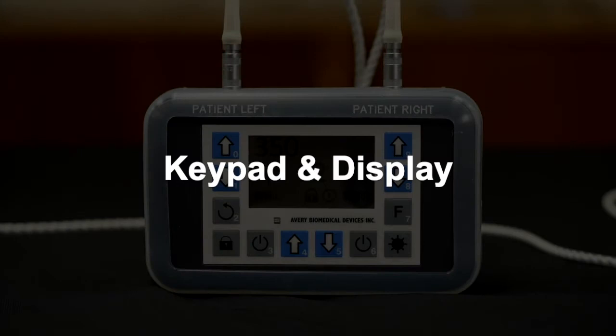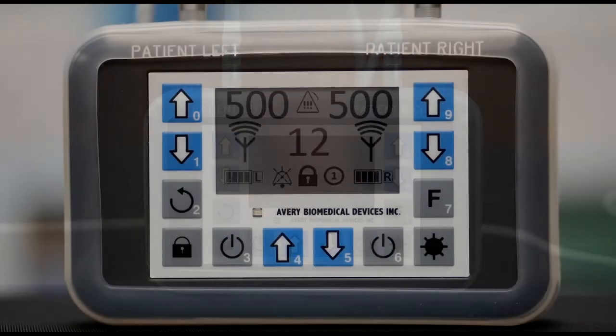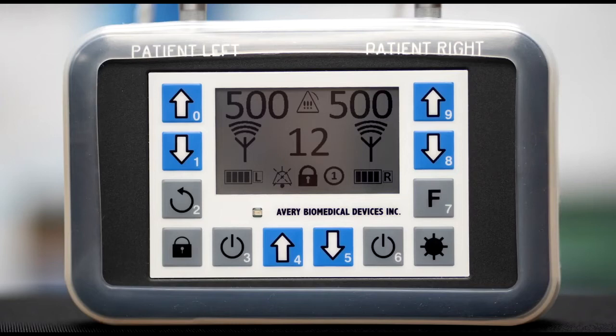Keypad and Display. The keypad contains 12 keys. Keys that are enabled generate a notifier sound to alert that the key press was acknowledged. The notifier sound is a short beat played from an internal speaker. The visual alarms have an LED indicator on the keypad overlay below the display.